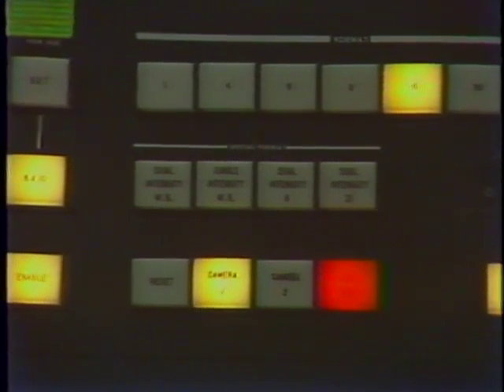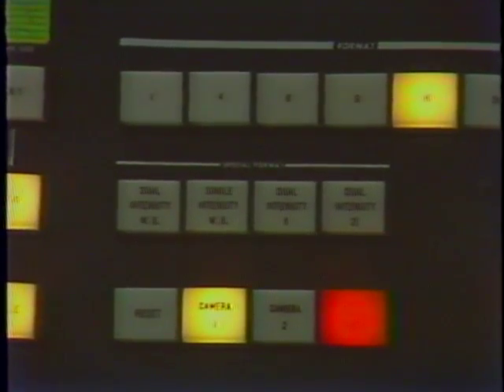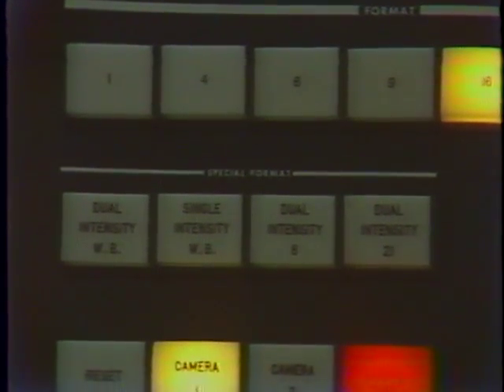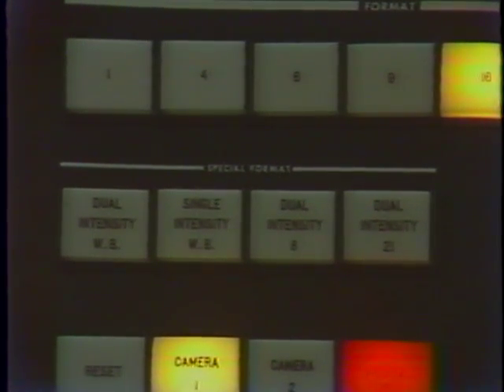The machine will turn the image on and off, turn the exposure on and off, and get it ready to go. The technologist would come in, get all this set up, then he would go over and inject the patient, and the machine would do the rest when he pushes the go button. Shall we do it? All right, let's try.